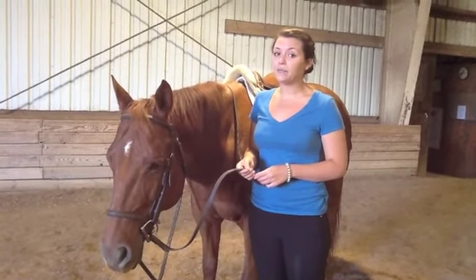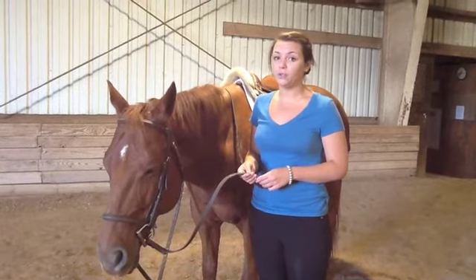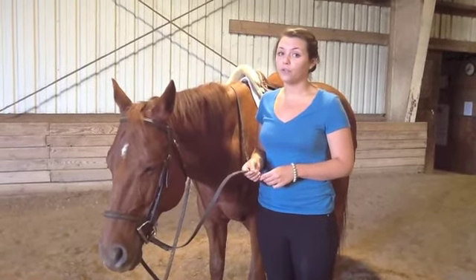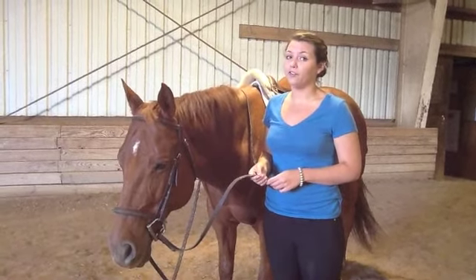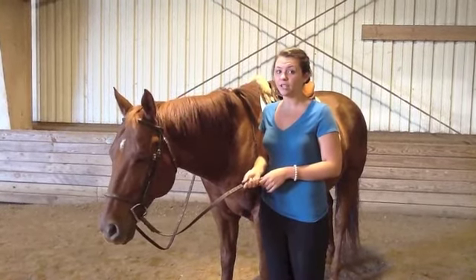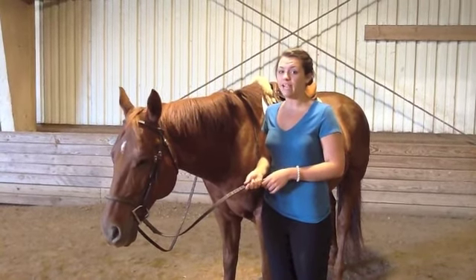Populations that may experience these difficulties include, but are not limited to, those with multiple sclerosis, arthritis, and cerebral palsy. Individuals with unilateral arm amputations may also benefit from the basic design of the rein. Beginner riders and riders with intellectual or learning disabilities may also benefit from use of the adaptive ladder reins.